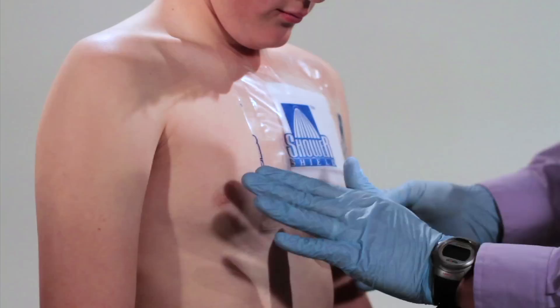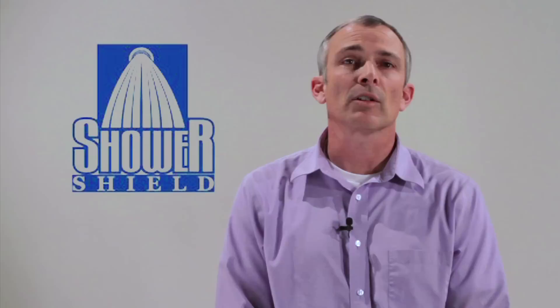If the patient is still connected to the IV tubing, make sure that the tubing exits the dressing from the body. And if you fail to get a good seal, peel this dressing off and discard it. Fix the problem and try again. These dressings are less than a dollar and it's not worth risking an infection for a dollar.